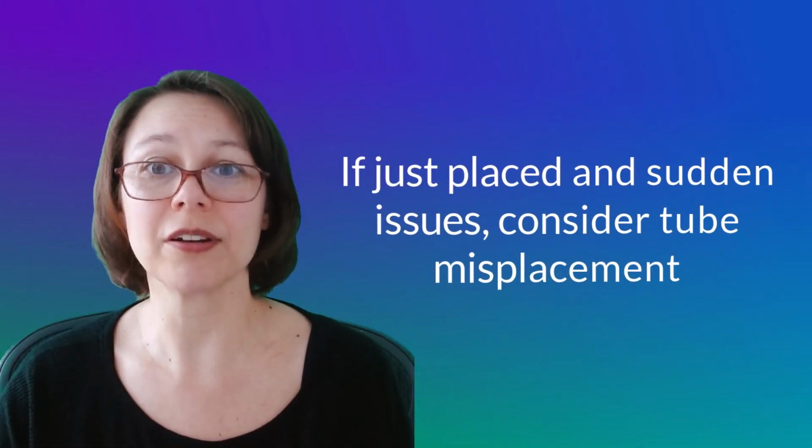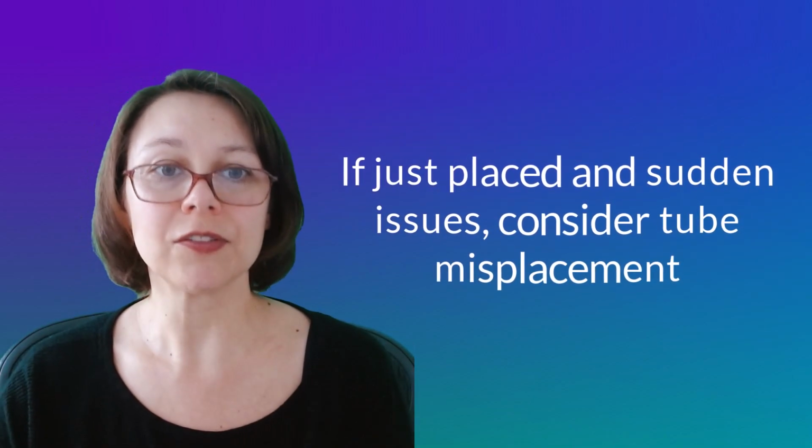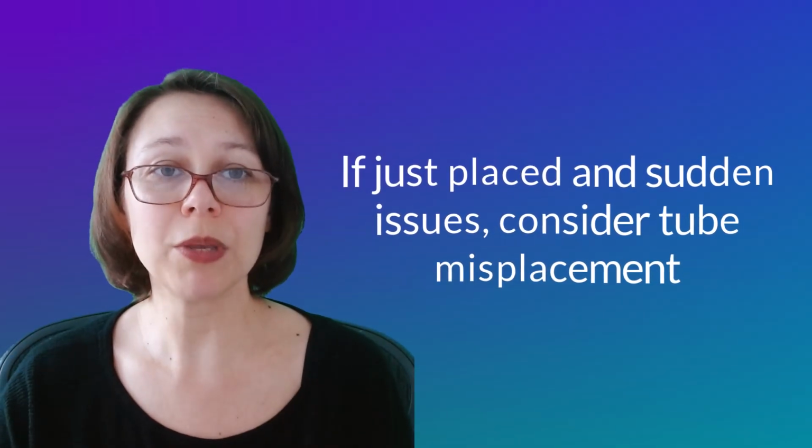One thing to consider if the trach was just placed and there's decreased breath sounds, significant distress by the patient, high pressure, low volume alarm, development of crepitus, then the tube may be misplaced and requires adjustment.